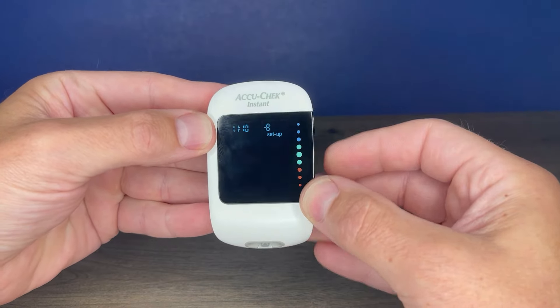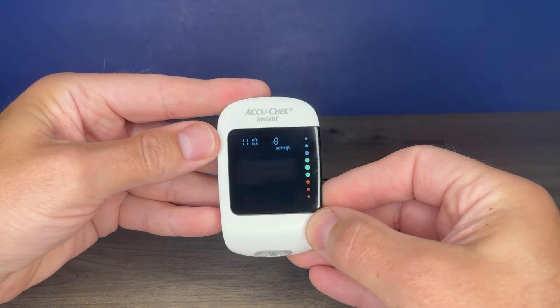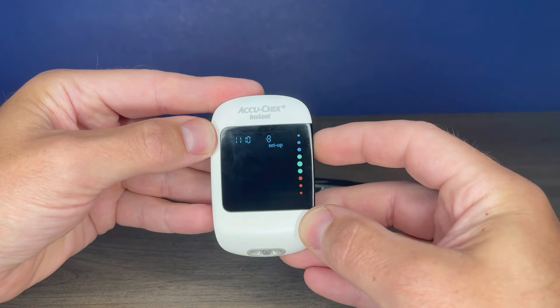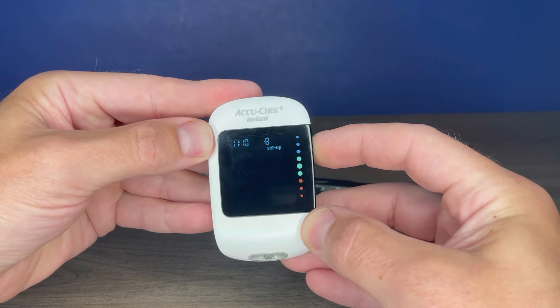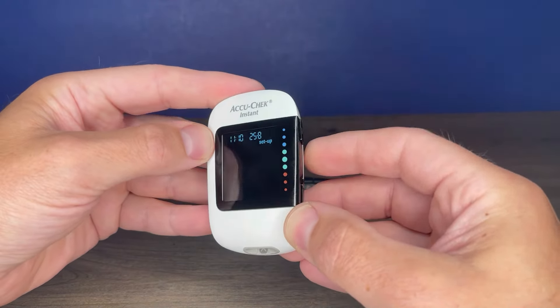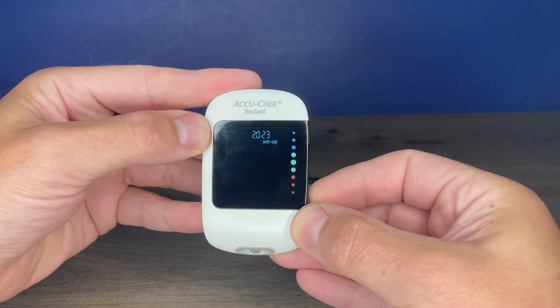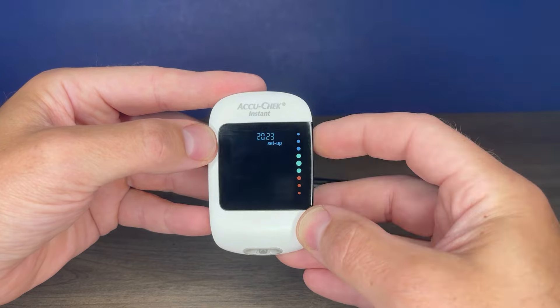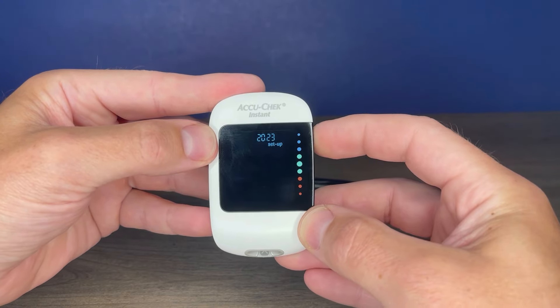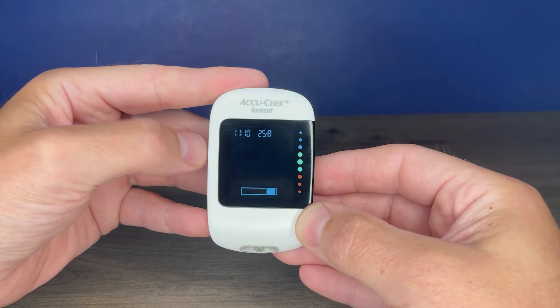Then you're on to the date. Use your arrow buttons to adjust. Once it's at the correct date, press and hold the top button. Then you're on to the month — again, adjust if needed, then press and hold the top button. Then you're on to the year. Adjust that as well with your up and down arrows, then press and hold. Now we're ready for testing.